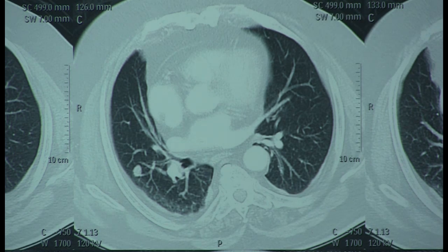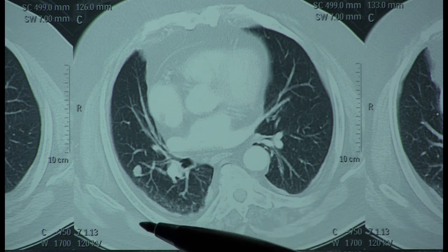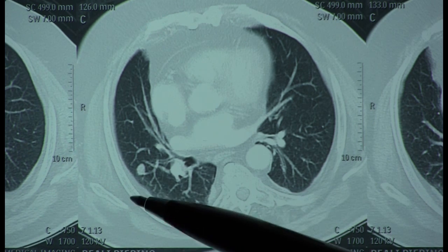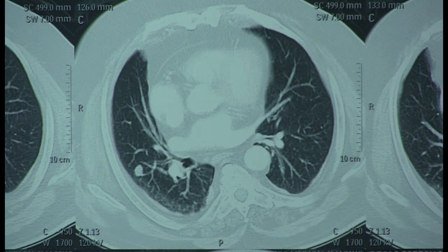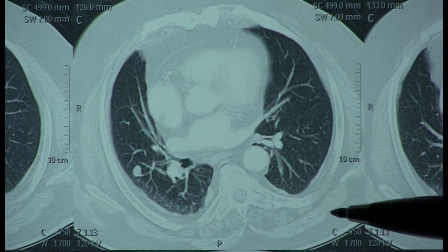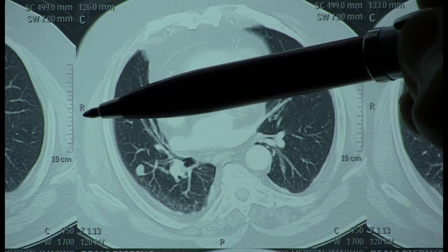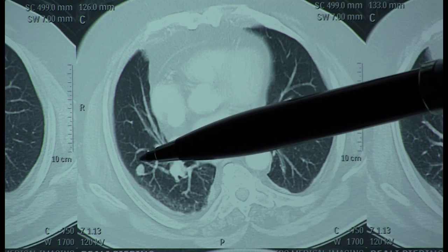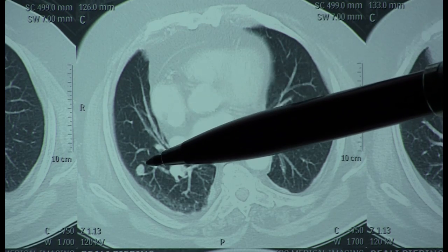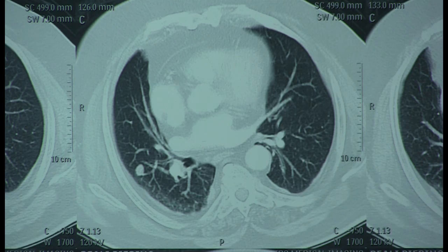As you can see he's generously proportioned — we're talking about a chap running a BMI comfortably in the mid-30s. Whilst we could approach this prone, which may seem desirable, the problem is that ventilating this 80-year-old prone is going to be problematic. So what we're aiming to do today is to come in with him supine, which makes it a lot easier for the anaesthetist, with an oblique approach — oblique in two angles. We're coming oblique in the XY plane but also oblique in the Z axis.